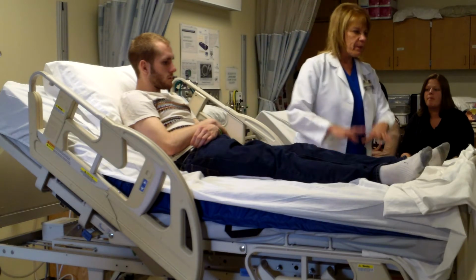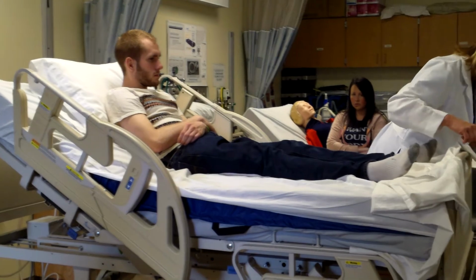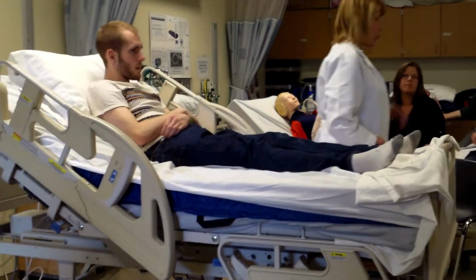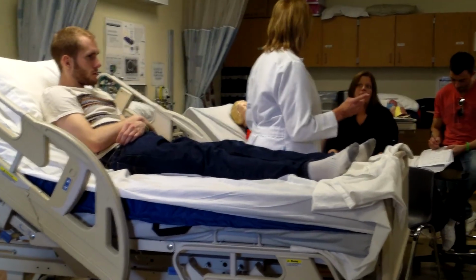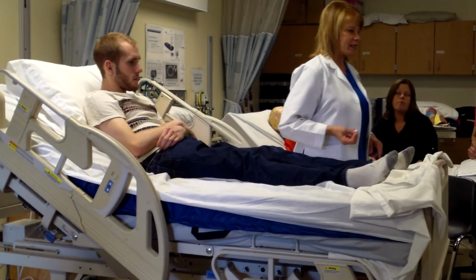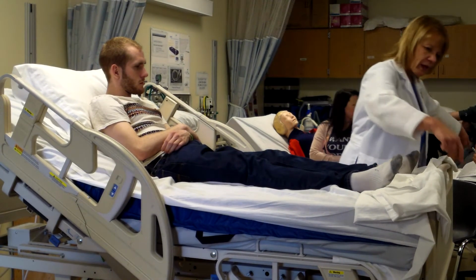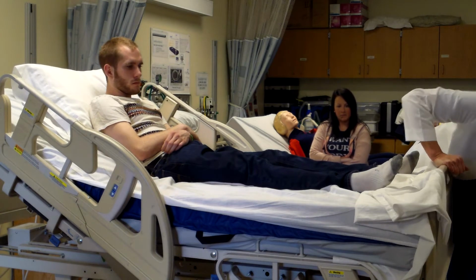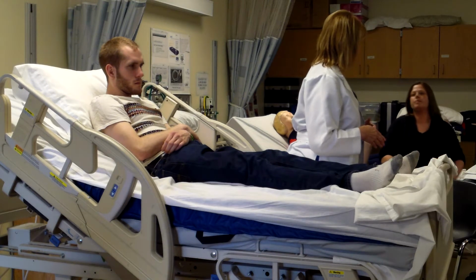Okay. So, bed's all the way up, as high as it'll go, and then you're going to go to the bottom of the bed, and there, underneath here, there are 2 little switches. One shows somebody with their head down, and one shows somebody with their head up. I want you to pull out the one that's got the picture of the guy with his head down, okay? So if you look at the bottom of the beds here, you can see that. So I'm just going to pull this out right here. Okay, and it pulls out and it stays out.